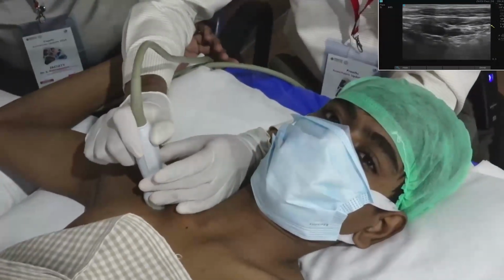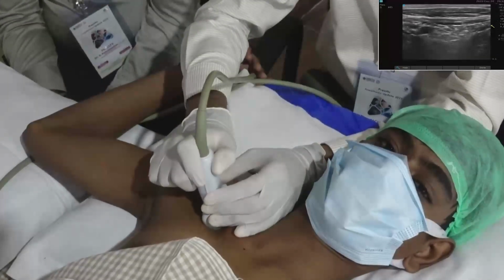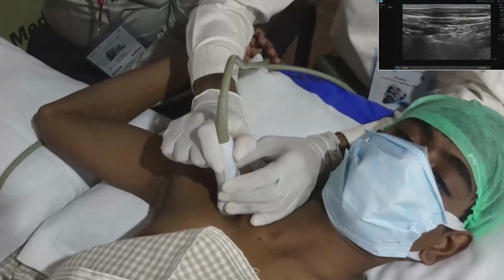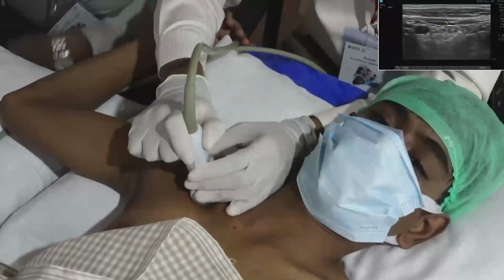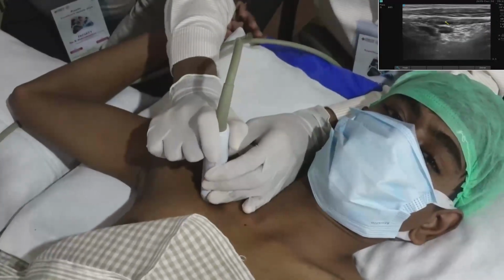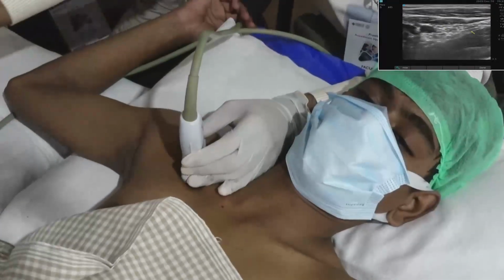You have to look for three structures. The superficial structure next to the skin and subcutaneous area is pectoralis major. Then the next structure is the subclavius muscle. Then you have to look for one more structure, that is serratus anterior, facing the depth.